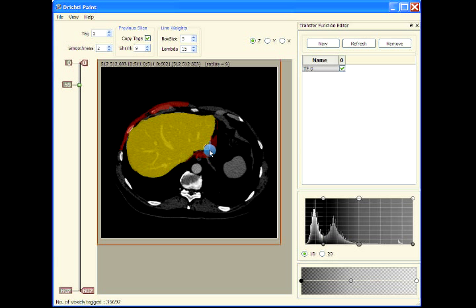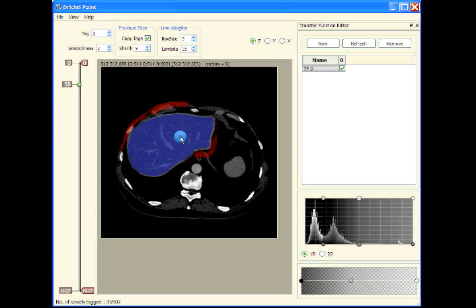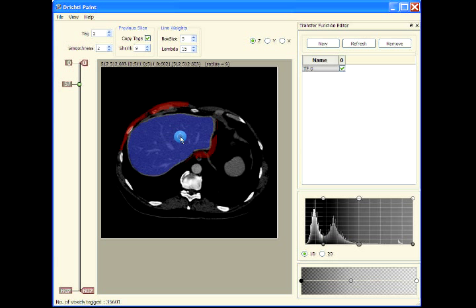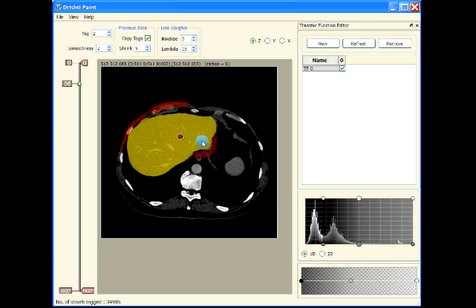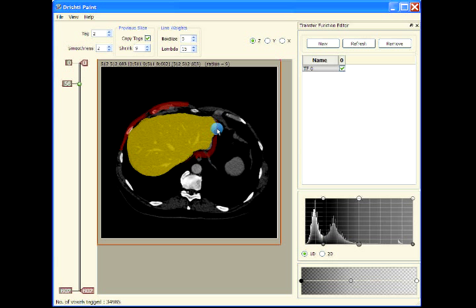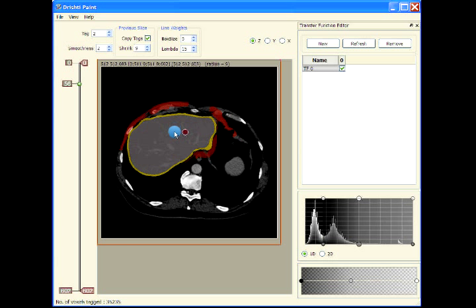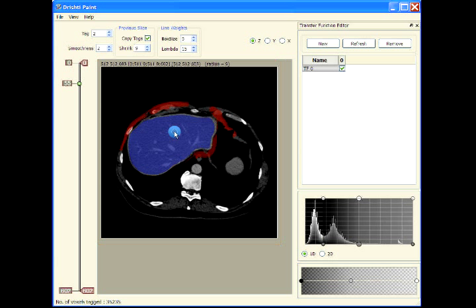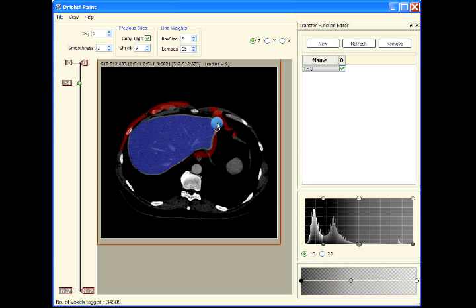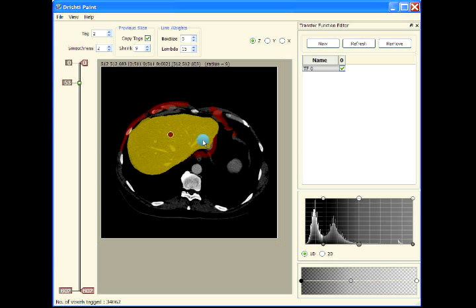Let's eliminate this portion here. I'm using the mouse wheel and then pressing T to get the segmentation. I am not applying the recursive Shift-T method that you would have seen in other videos.